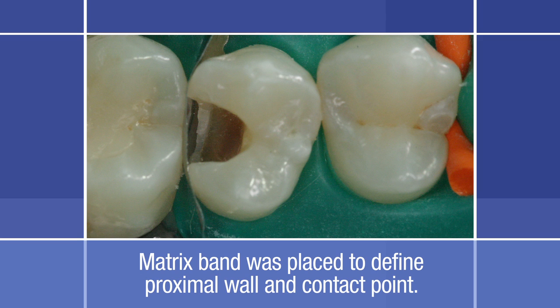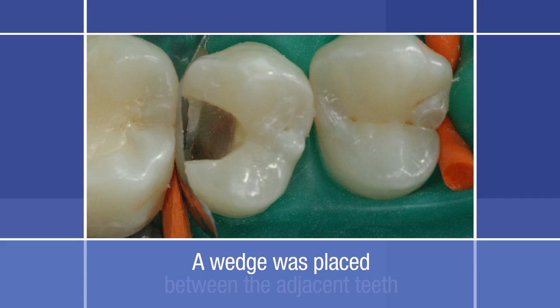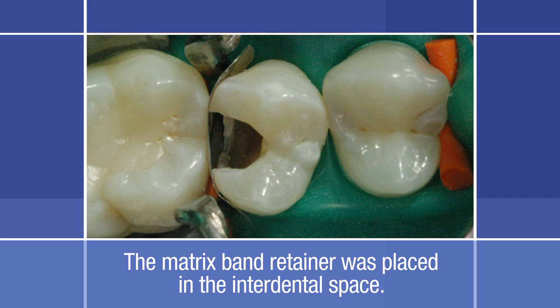The size of the matrix should be chosen according to the height of the proximal wall of the cavity. The upper limit of the matrix must be positioned exactly at the level of the marginal crest of the adjacent tooth. A wooden wedge was then placed between the two adjacent teeth at the gingival limit in order to flatten the matrix band against the gingival limit. Placement of the wedge is essential in order to obtain physiological movement of the teeth. When the restoration is complete and the wedge is removed, the teeth will migrate to their initial position and a functional contact point will be obtained.